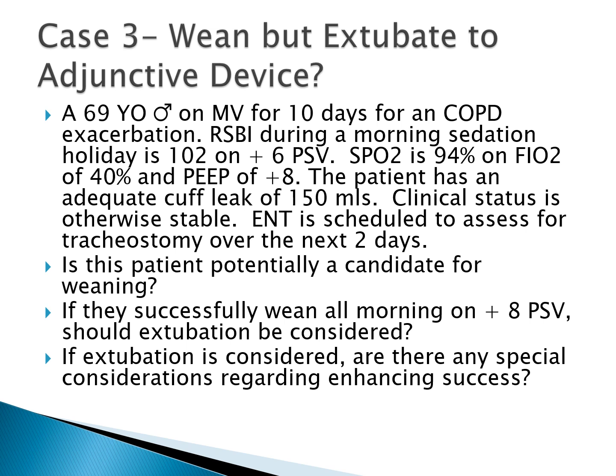The patient has an adequate cuff leak, so that's really not an issue. Clinical status is otherwise stable. The ENT, ear, nose, throat physician team, is scheduled to assess the patient for a tracheostomy over the next 2 days, so this patient is kind of headed in that direction. Is this patient potentially a candidate for weaning?